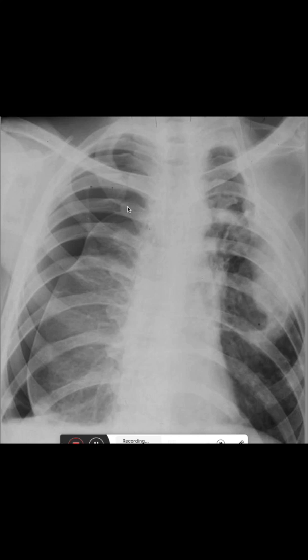What you can see here is the absence of lung markings in the lateral spaces of the right lung and the hypertransparency. The lung markings go up to this line where you can see that the pleura has collapsed.